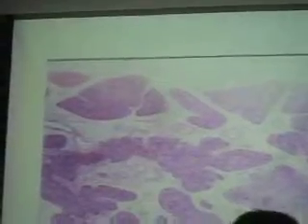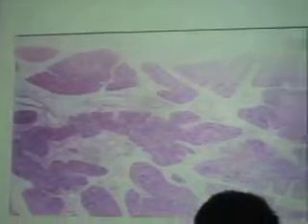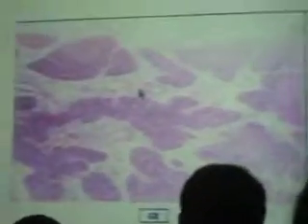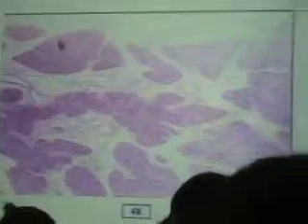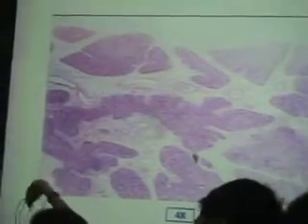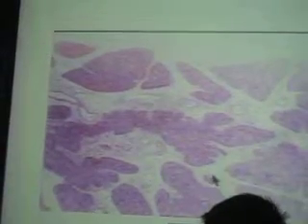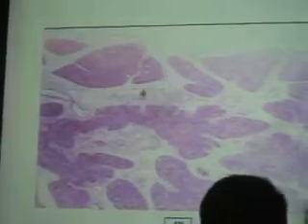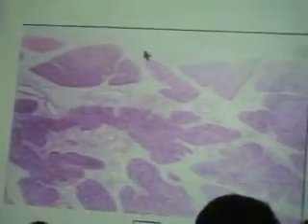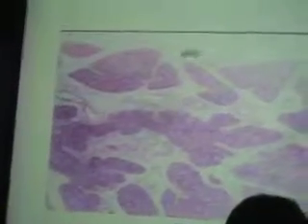It seems like there is lobation. Do you have lobes in the lymph node? None, right? So what's this? You have your connective tissue in between the lobes, but actually incomplete lobation, surrounded by dense connective tissue, and you have there the capsule. So it's one of the encapsulated lymphoid organs.